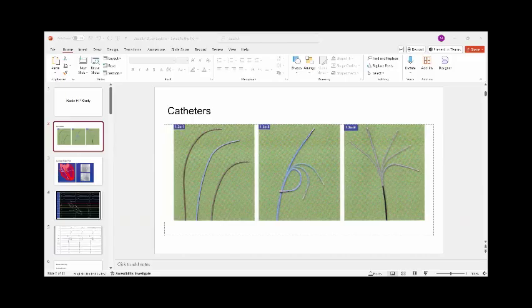And this is a very important concept to know when you take a patient to your EP lab to do a study. You need to review all his ECGs to make a plan. Does this patient have SVT or not? What is the most possible diagnosis of his SVT? Be ready with a plan and prepare your protocol of management. So this is mostly atrial tachycardia. Here we have a termination of atrial tachycardia.